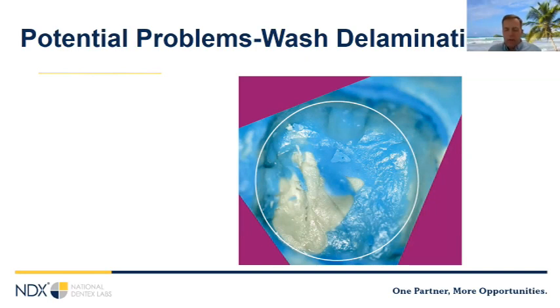The other thing is that theoretically, there's really no way to get the perfect amount of material in there. You're either going to have too much or too little. If you have too little, you're not going to capture the impression. So most of us tend to err towards having a little bit too much. Well, when you push that impression down, eventually it's going to reach the point where it seals. And especially if the patient's biting on it, the occlusal force can actually balloon the impression material a little bit while the light body material is setting. So you take it out of the mouth, it springs back. And again, you wind up with that same problem we talked about, where the die is a little bit smaller than the actual tooth and the crown doesn't seat all the way.